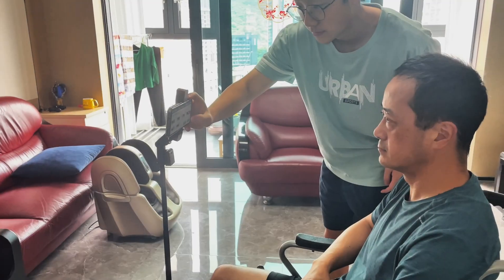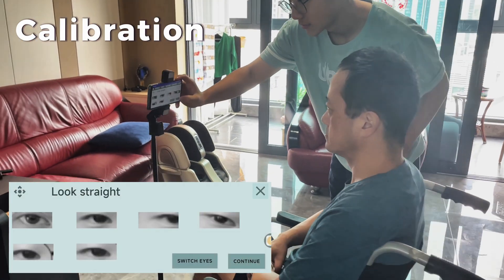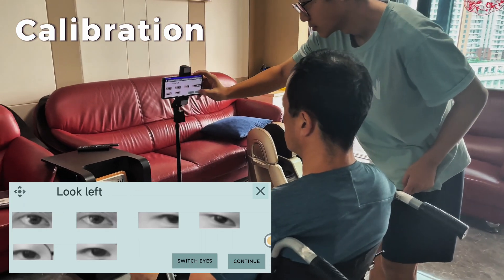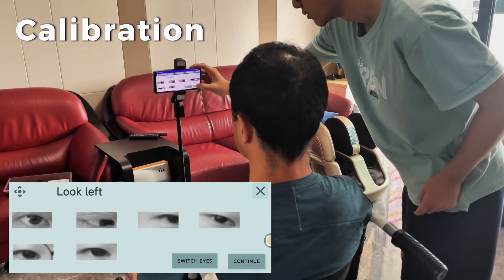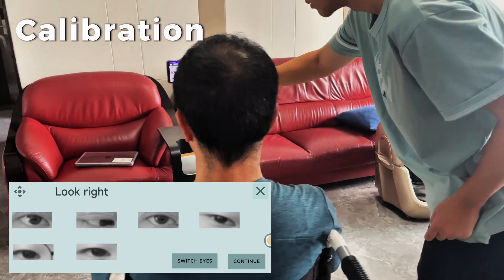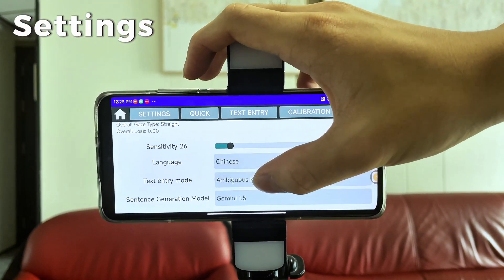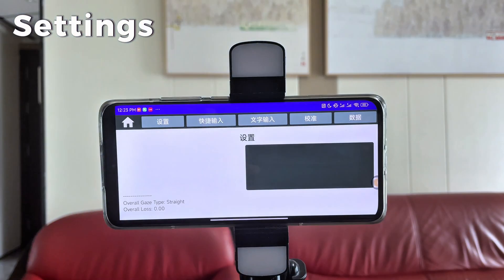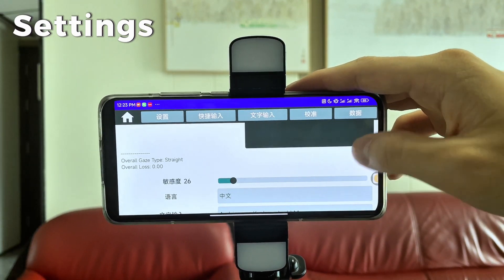First, a caretaker will help the patient calibrate eye gestures like left, right, up, and close through a user interface. Then, the caretaker can adjust settings like sensitivity, language, and text entry mode based on the user's needs.